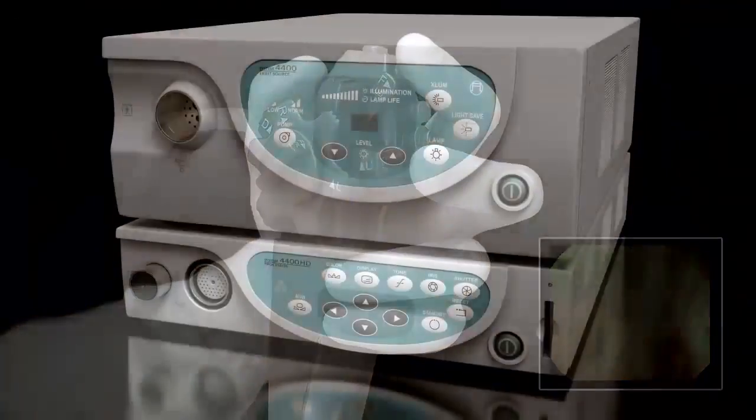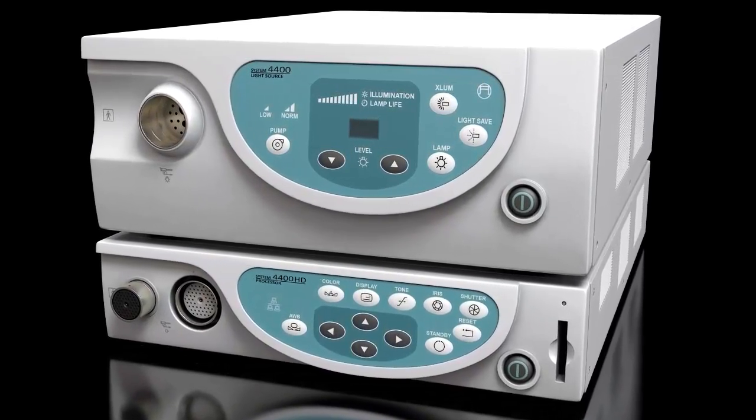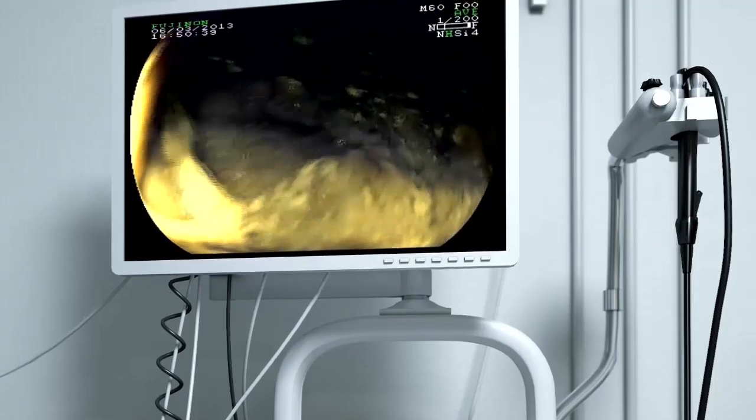The FICE system and iScan system are based on the same physical principle, but they do not use optical filters, but digital image processes that intensify certain wavelengths for revealing details of the mucosal structure.